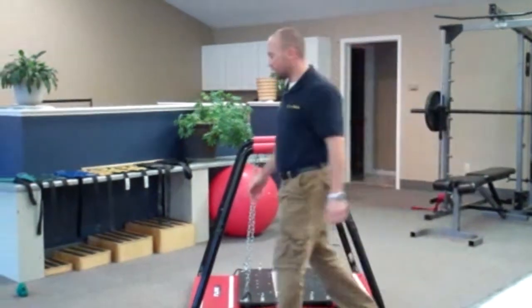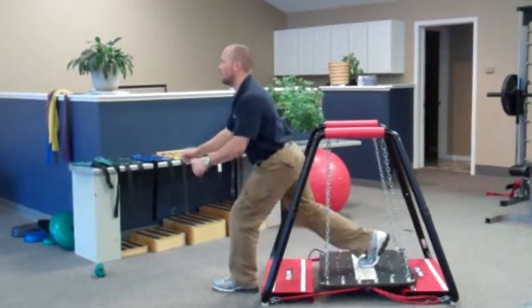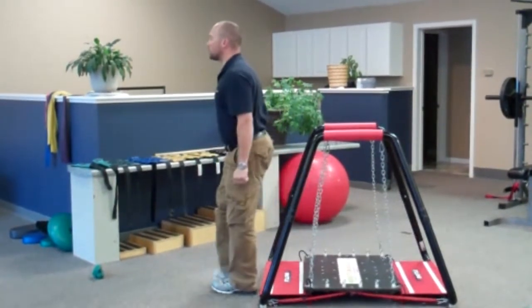Now finally, the back lunge. We're trying to maintain good posture control.